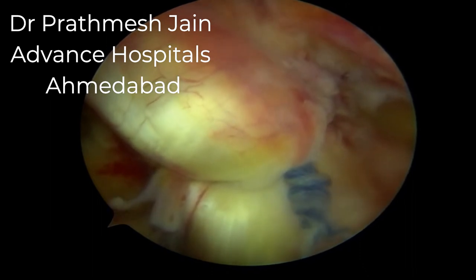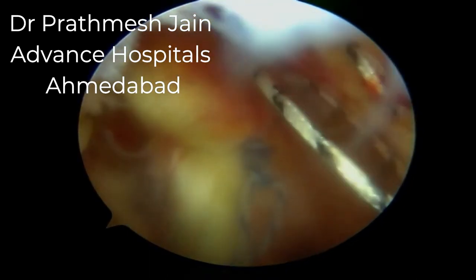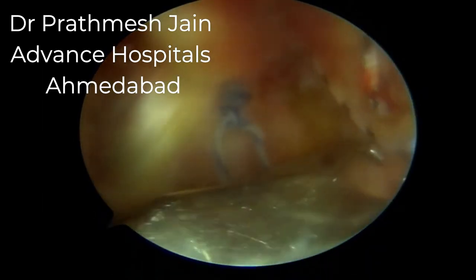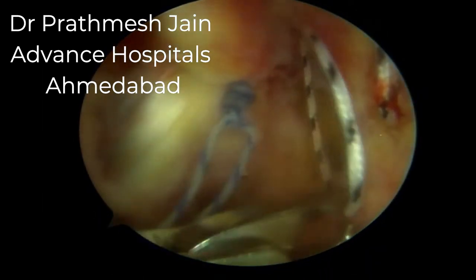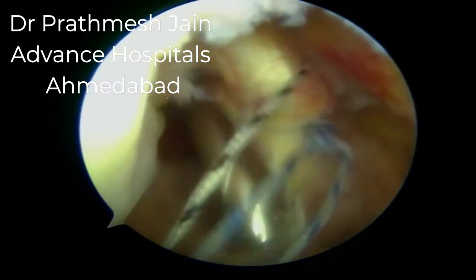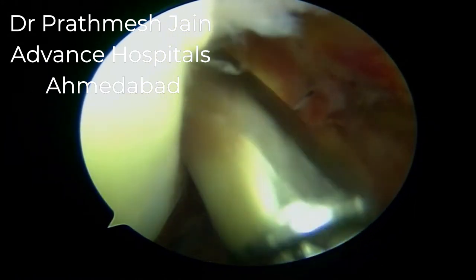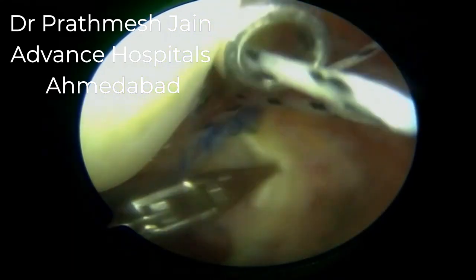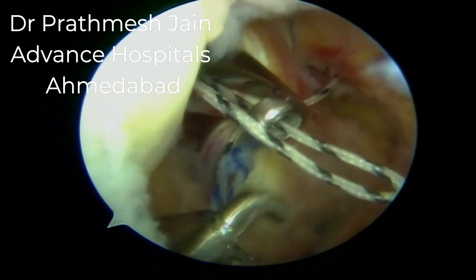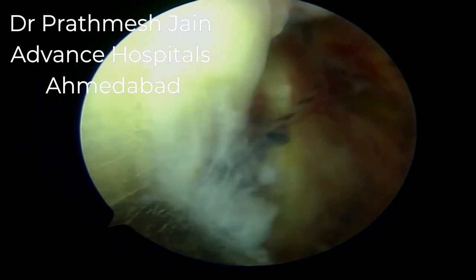In earlier cases we observed loosening due to a single wire loop, so we now use two wire loops. We insert the second wire loop, which is black in color, passed from the superior aspect of the PCL. The other loop is passed through the knot pusher on the inferior aspect of the PCL and retrieved from the low posterior medial portal.